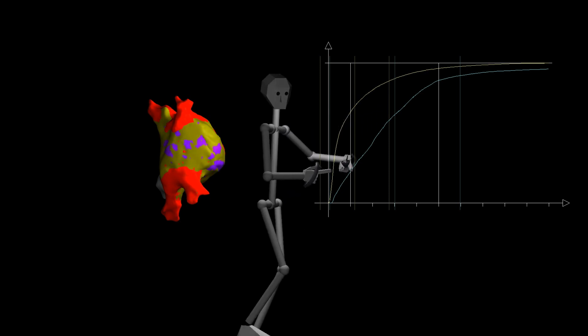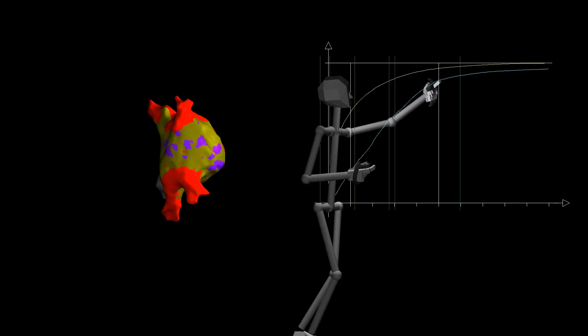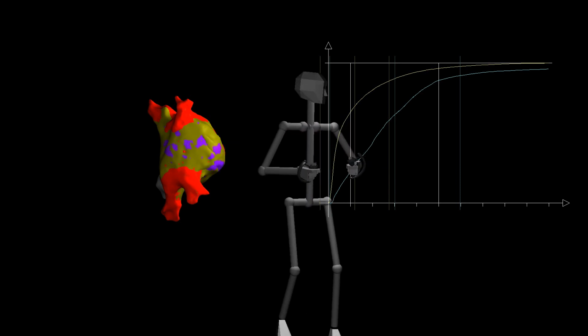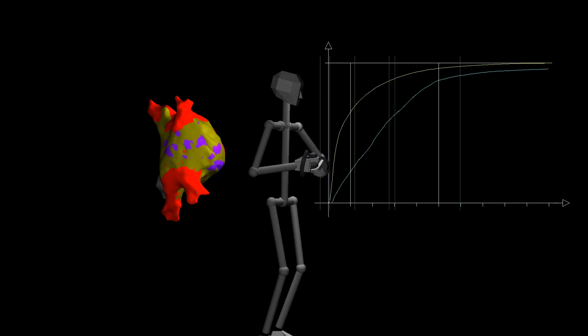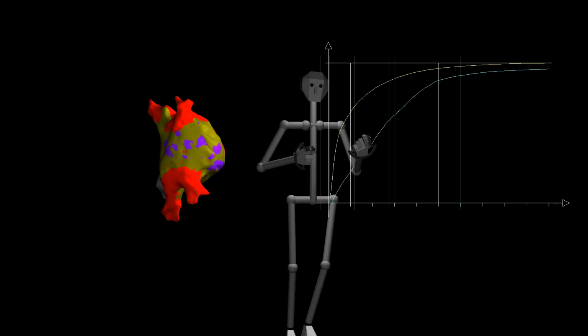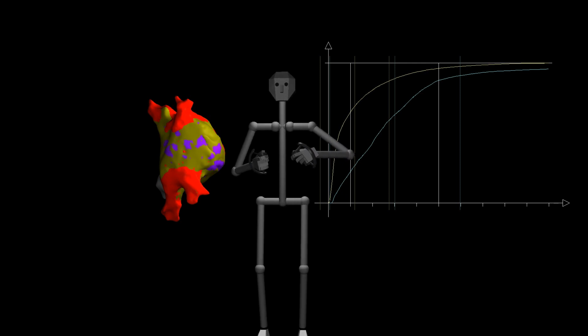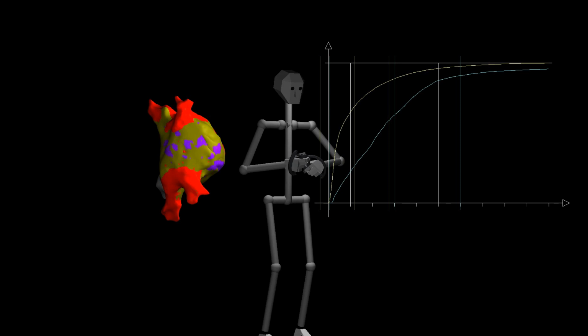And so this is the input data that gets fed into the prediction algorithm, which is the area fraction of the heart surface below 0.1 millivolt and the area fraction above 0.5 millivolt, and we are tracking those through the entire data set of 44 patients in order to train a prediction model to not only tell us what type of atrial fibrillation we have, paroxysmal versus persistent, but also what the patient's potential response to the cryoablation treatment is.